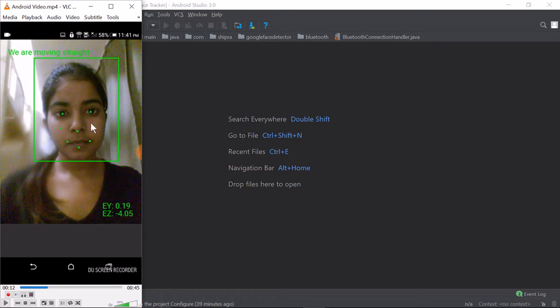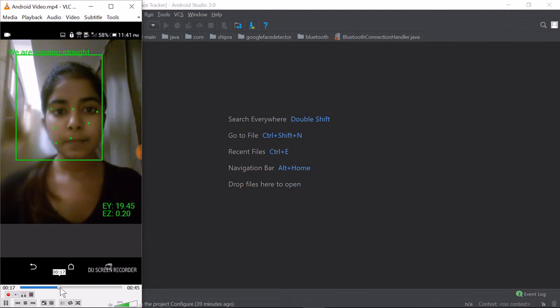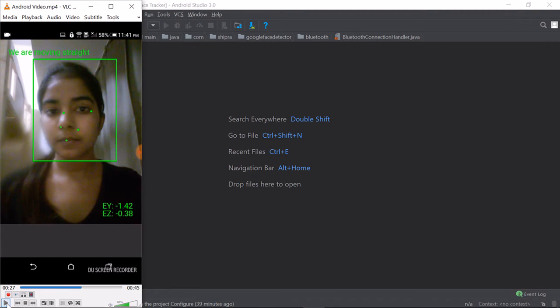These are the landmarking points that we have provided. This is just for the user to see where exactly the robot or the wheelchair is moving. These are the Euler angles Y and the Z with respect to the face and the camera position. So while we turn left, we have the change in the Euler angles and we get something written on the screen that says that you're moving left. Similarly, when you start moving right, the box tracks and it makes it move right. So this is how basically the code runs.